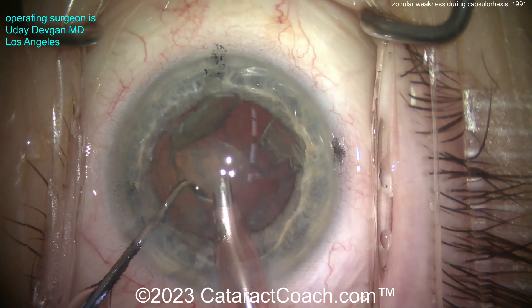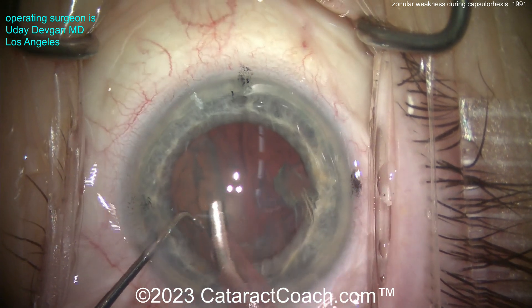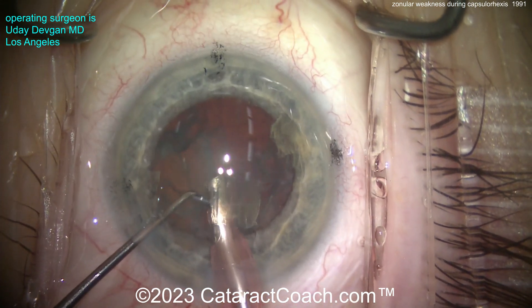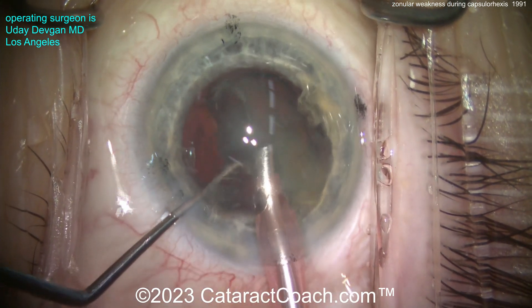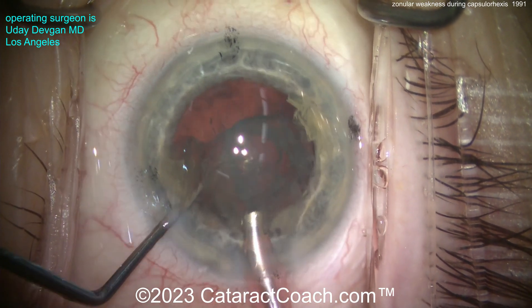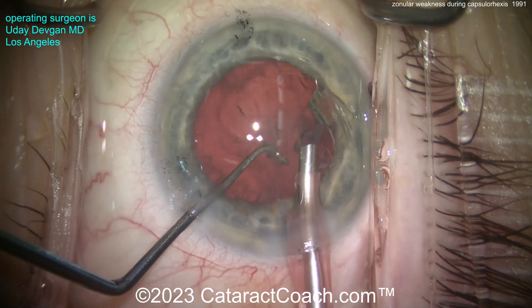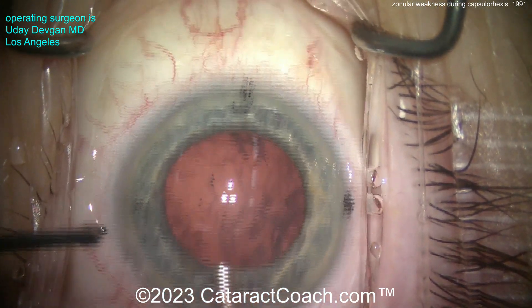We'll take the other piece out and watch carefully for further zonular weakness. The question is: do you need to put in a capsular tension ring or not? Maybe not — I'm not sure it's going to be of huge benefit here. It was normal during the rhexis creation, other than starting the rhexis. There is some laxity — it's not a very tight anterior lens capsule — but while we tore the rhexis after starting with a cystotome, it didn't wrinkle up too much. We didn't need counter-traction. This all looks pretty good.